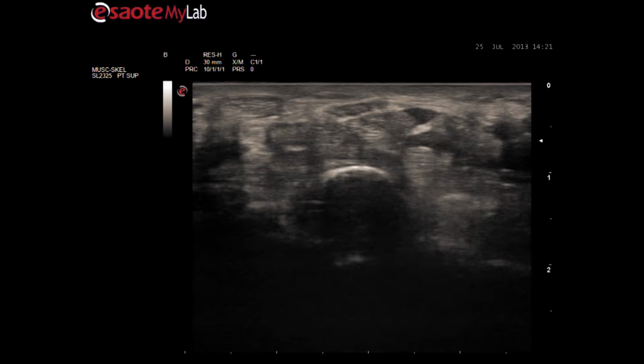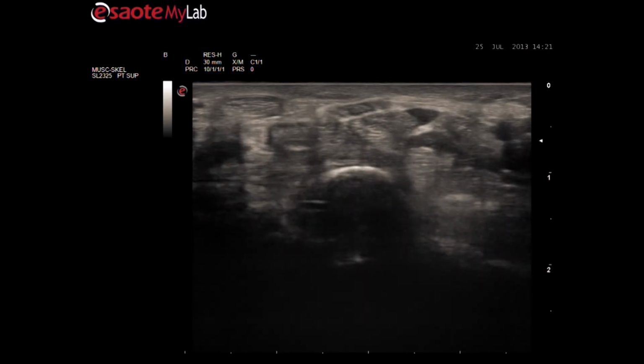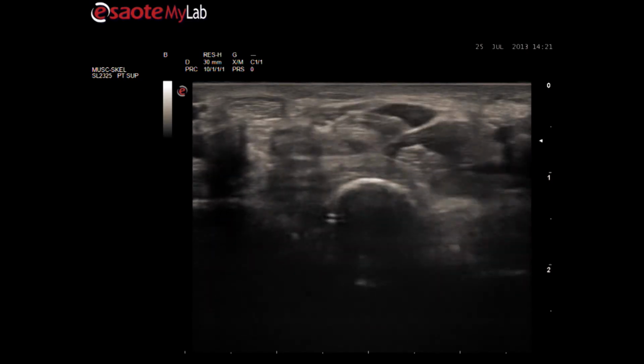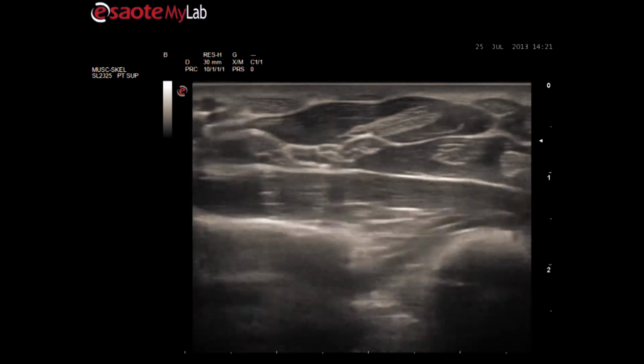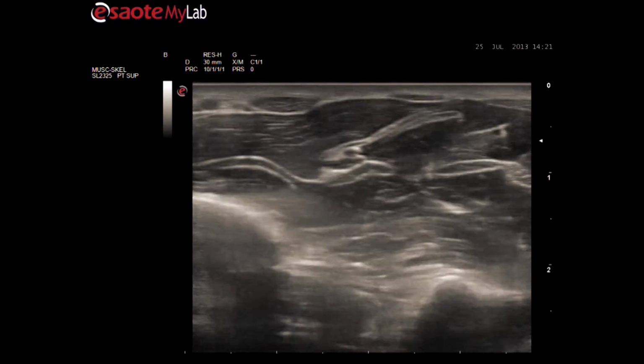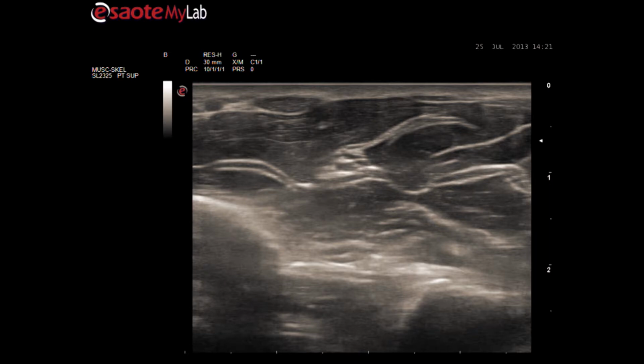See the median nerve moving from left to right and the underlying flexors rotating around their axis. We can follow the median nerve in its course to proximal. The median nerve can be seen as a white honeycomb-like structure at 1 cm depth in the middle of the screen.